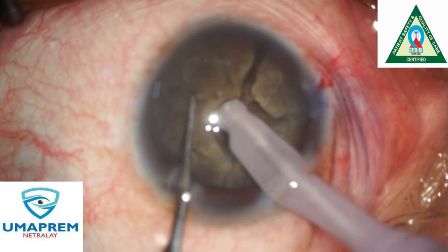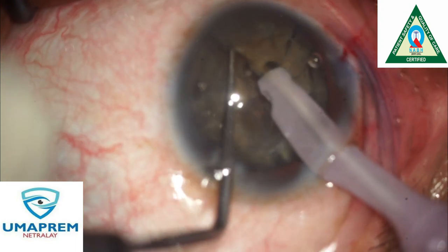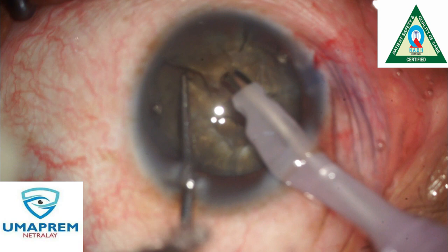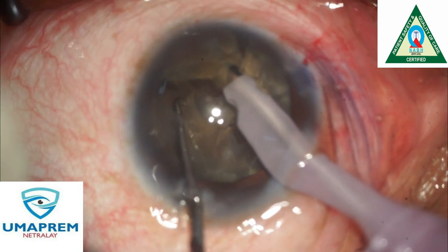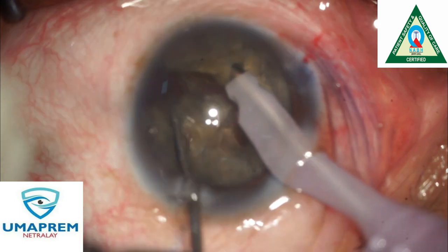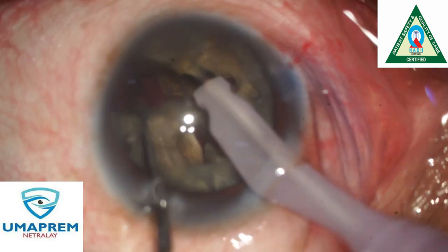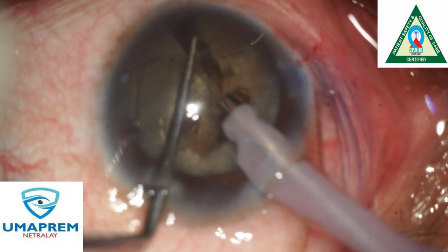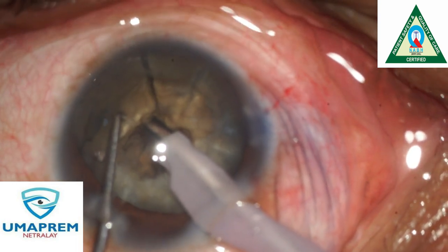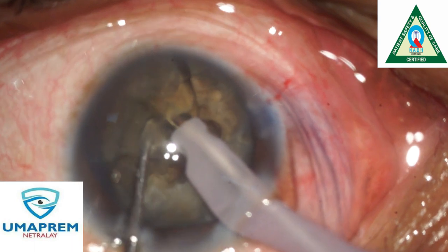The chop must be deep enough to crack the plate of the central part. Here — see the complete cracking of the two parts. After complete cracking, we divide the nucleus into 6 to 7 pieces.